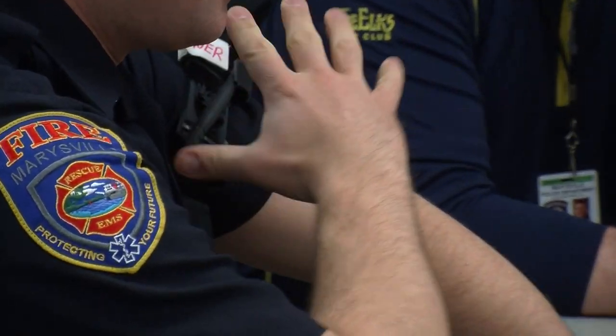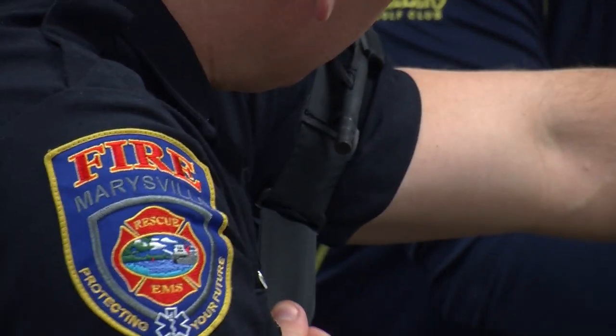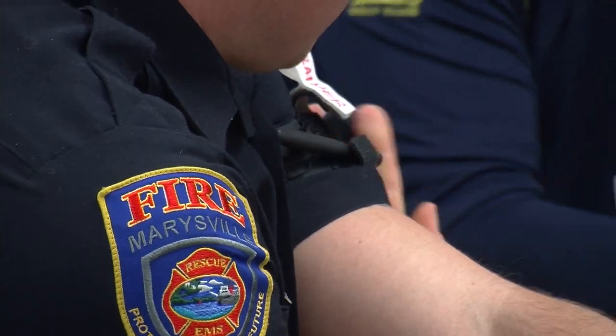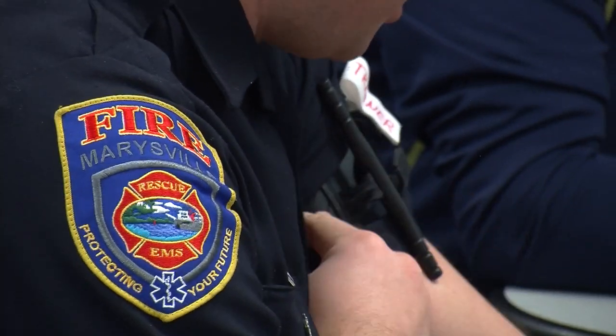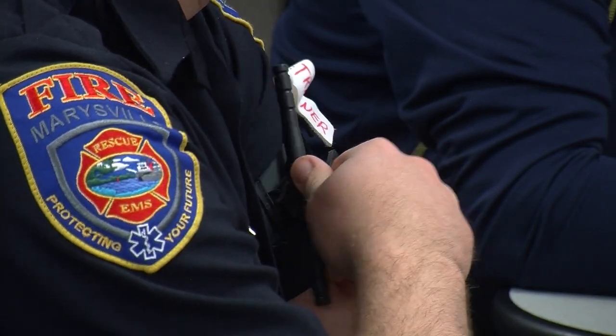You always want to make sure you keep this windlass, this rod here, reachable, because that's going to be what you use to cinch it up. So once you get that through as tight as you can with the Velcro, just push it back on itself. And if you get it really tight with just the Velcro, you probably won't get more than a full turn out of the rod here.